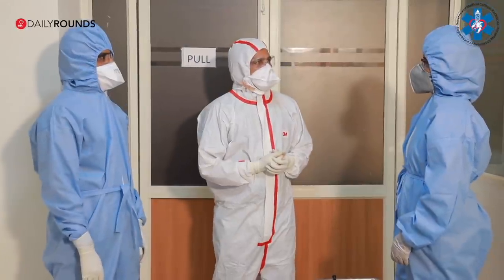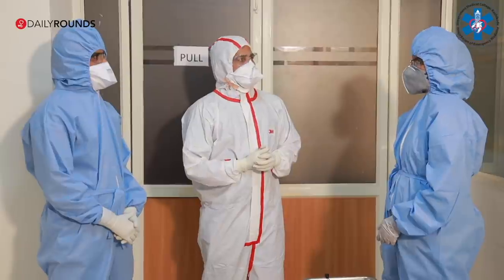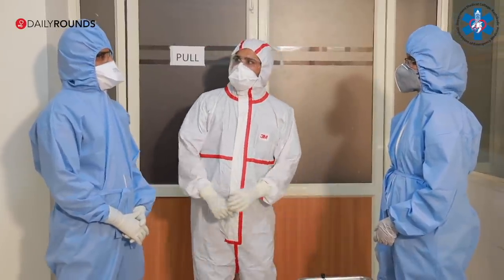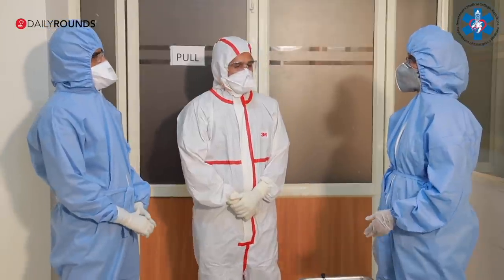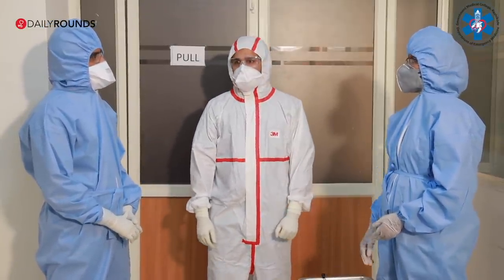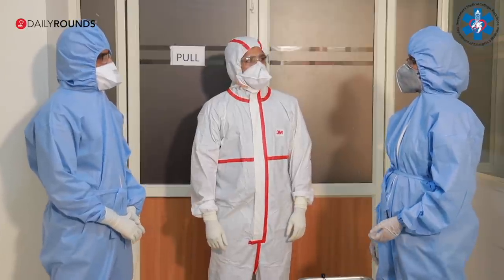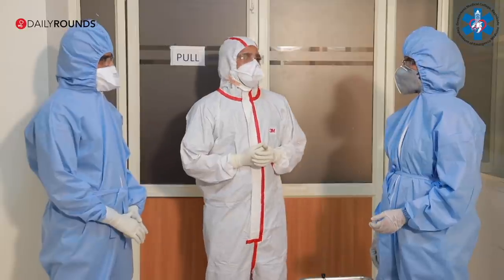Hi, I am Dr. Kavita, emergency physician. Please introduce yourself. I am Dr. Arshad Fazal, I am also an emergency physician. I am Dr. Akhil, I am also an emergency physician. So in our team, Dr. Arshad is the most senior person among us, so he will be the intubator. And Dr. Akhil, you can be the airway assistant. Sure, doctor. And I will be the team leader, as well as I will be dealing with the drug side. I will monitor the patient also.